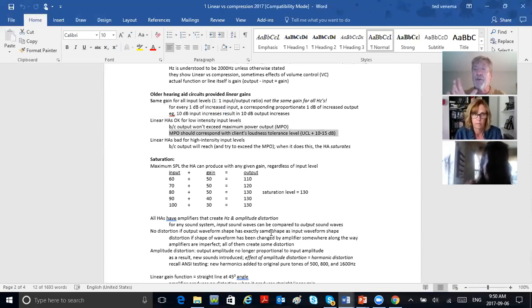Now, let's say you're doing a hearing test on somebody, and the person raises a hand when it's about 100 dB. Now, have you learned any of this in audiometry class so far? Have you learned about uncomfortable loudness testing? Yeah. Okay. So if a person's loudness discomfort level is, let's say, 100 dB on the audiogram, remember the audiogram is in dB HL, isn't it? It's not dB SPL. Hearing aids are dB SPL.